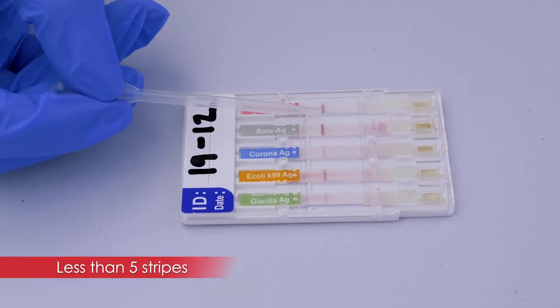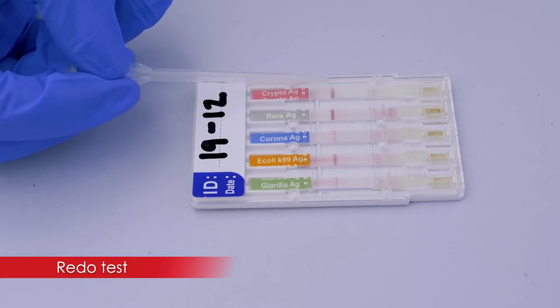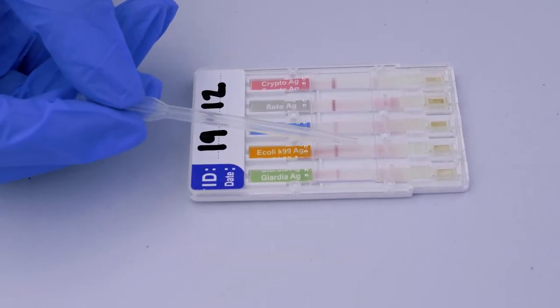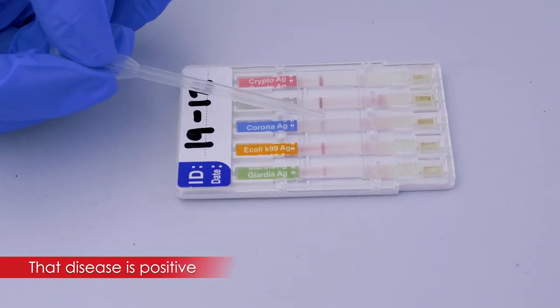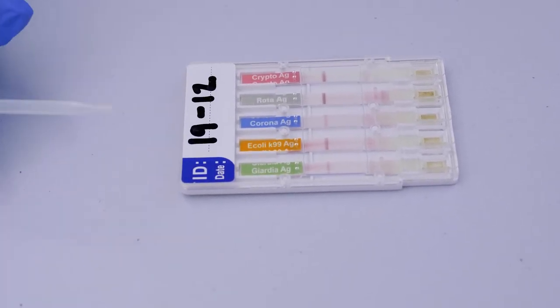If you don't have one of these stripes it means you need to redo the test, since something went wrong — this stripe is your control to show it worked. But if you have an additional stripe in the test area, it means that test is positive. For example, if you have corona with two stripes, it means that calf has corona antigen present in its sample.